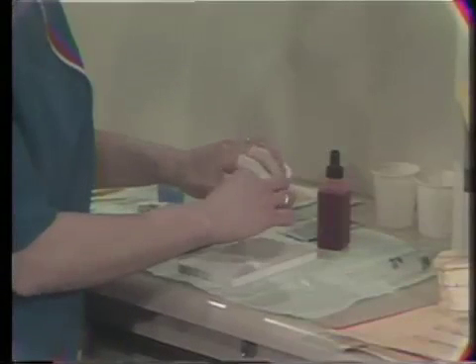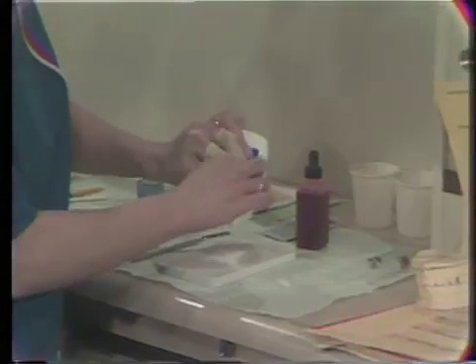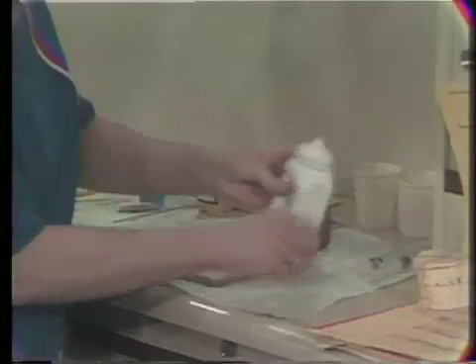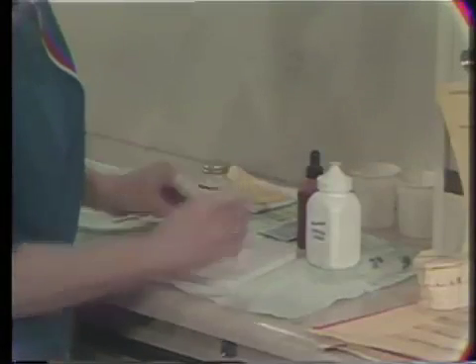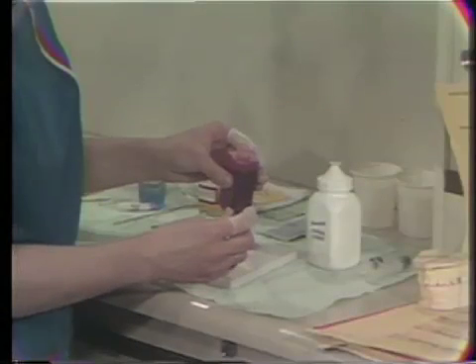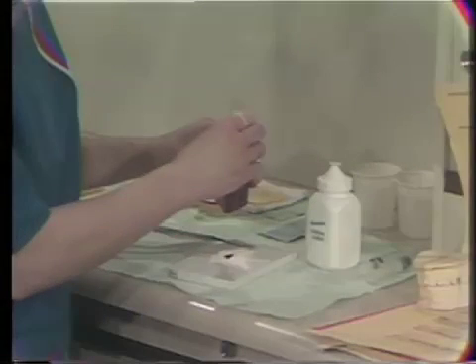When doing periodontal surgery, it's possible, on the basis of experience, to know about how much material is needed so that the assistant can mix the adequate quantity necessary without having too much or too little. And you can see there Betty's putting out the powder on the pad, and she'll now add 12 drops in the middle of that powder where she made a little hole, so there's a crater in the center of it to hold in the 12 drops.